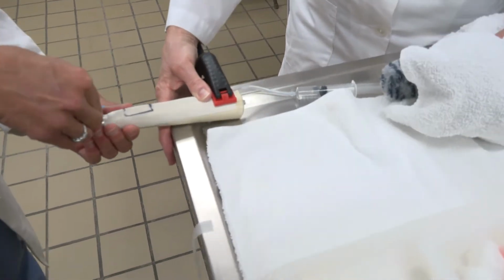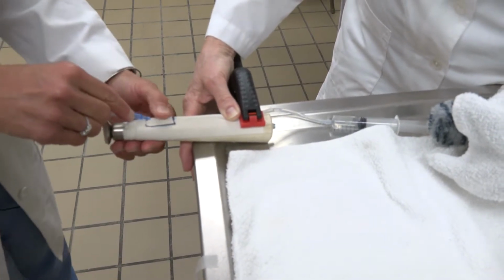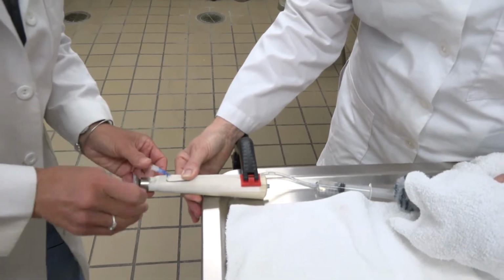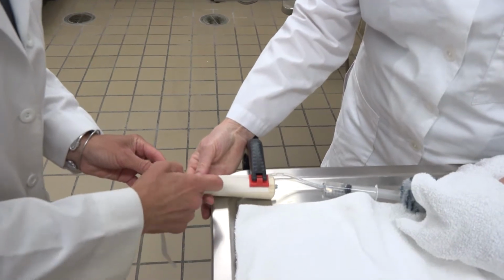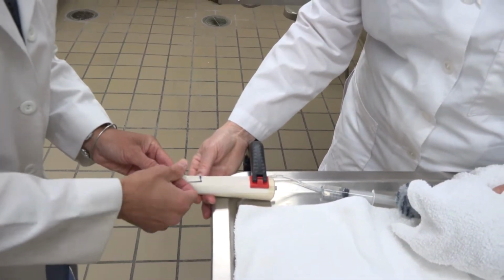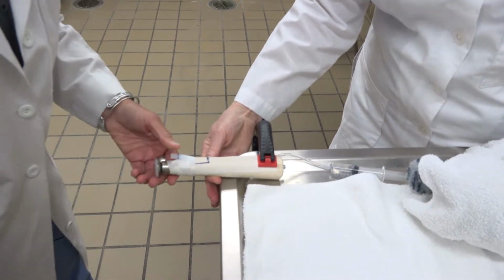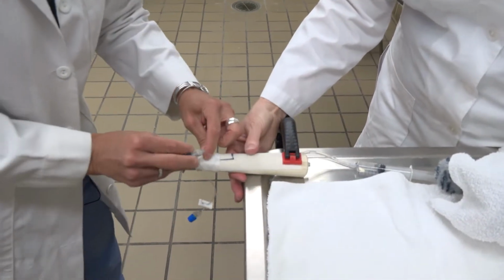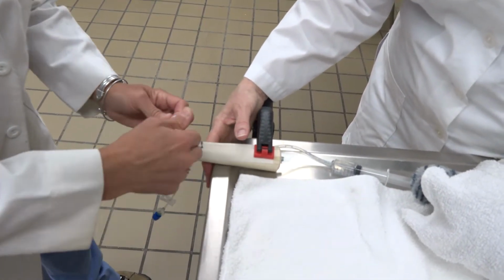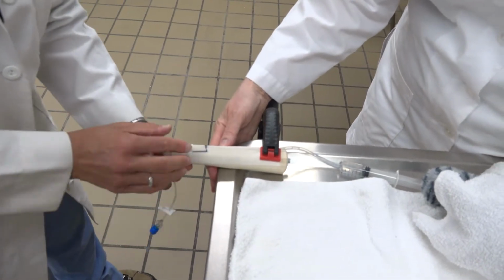Okay, can you hold off? Yep. I have a flash, I'm going to advance, and now thread. Can you hold off here? Sure. I use the nubbin from the catheter. Skinny. Going over. Wide, under. And T-pull. Crotch to crotch. And flush.